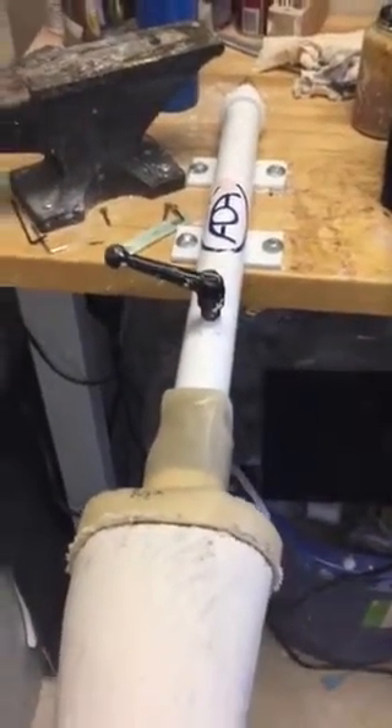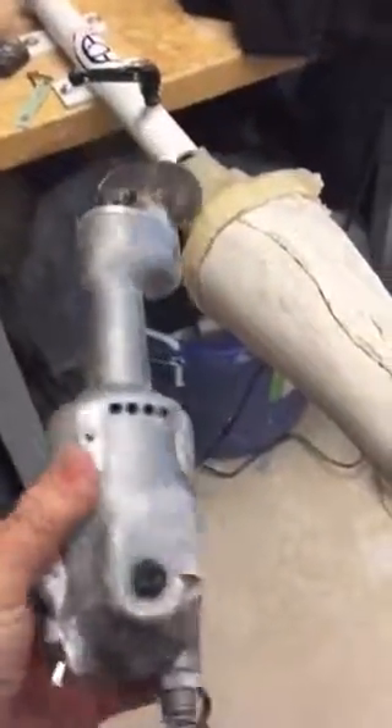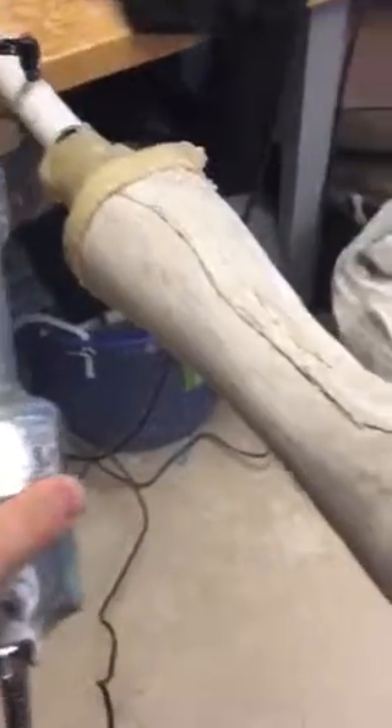This is just part of the fabrication process. We use the manifold so we can now turn and work on the cast as we cut it down. We use something called a cast saw to do that when making our AFOs.